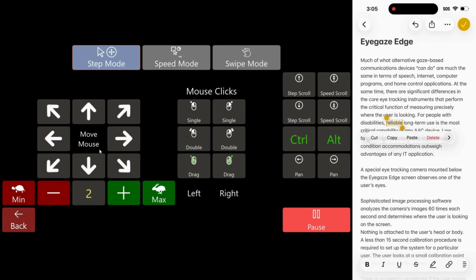You will notice the gold drag handles appear at the top left and bottom right corners of the selected word. Now, move the cursor so that the gold dot on the bottom right is centered with the cursor, and then turn on drag. From there, increase the step size and move the cursor down. You'll see that the text below is being selected.